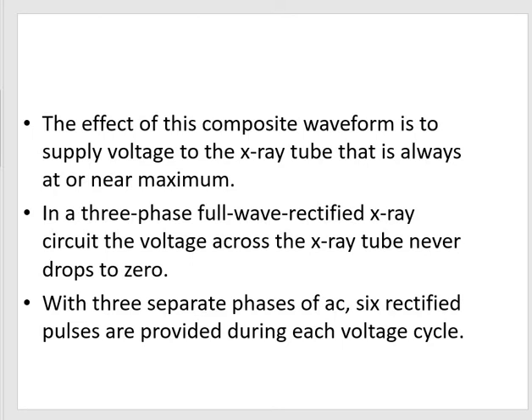In a single phase power supply, the power is distributed using these two wires, and the AC power takes the shape of a sinusoidal wave. The voltage in a single phase supply peaks at 90 degrees during the positive cycle, and then peaks again at 270 degrees during the negative cycle.